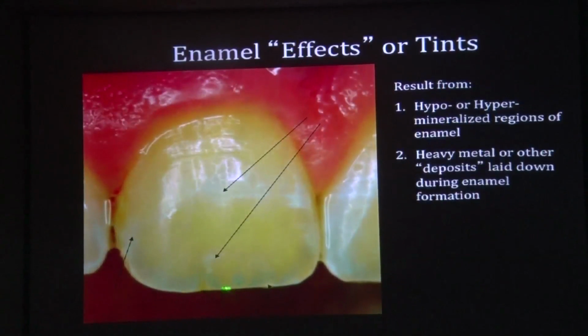Then tints. We also have tints available in the market. You have colors. You have brown, light brown, medium brown, white, blue, grey. You have everything. So keep those tints. Sometimes you never know, you have to mimic some spots. You need those.